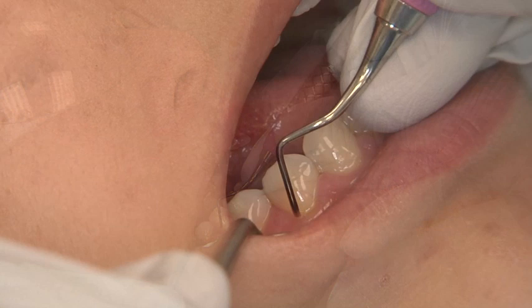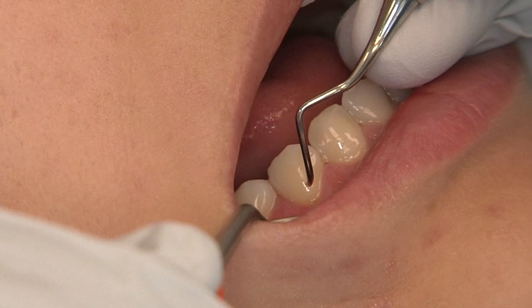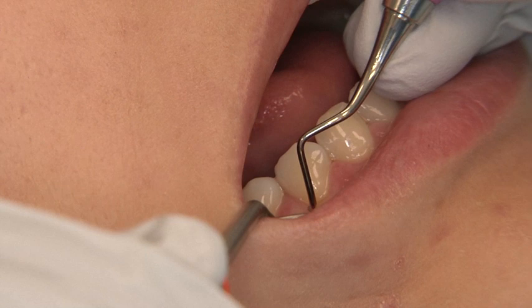Light lateral pressure is used for the initial assessment stroke to detect any calculus deposits. Firm lateral pressure concentrated on the lower third of the blade is applied prior to and during instrumentation by applying more pressure against the instrument handle and on the fulcrum finger against the tooth. For the calculus removal stroke, medium lateral pressure is applied with a series of short continual strokes.